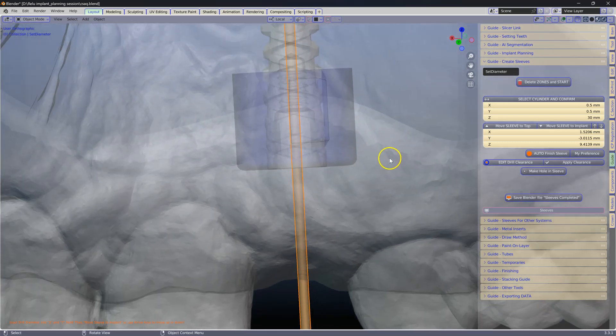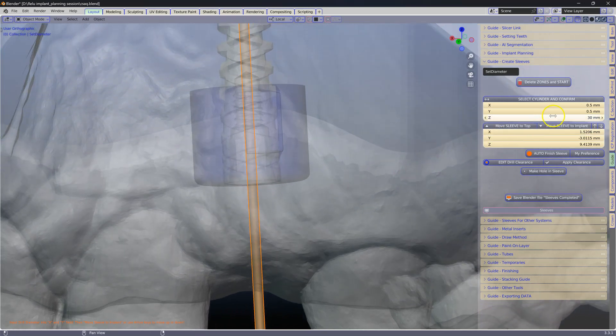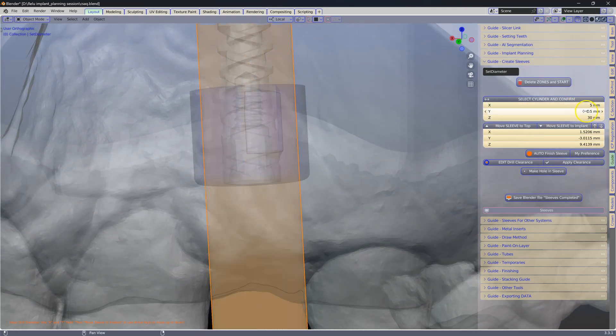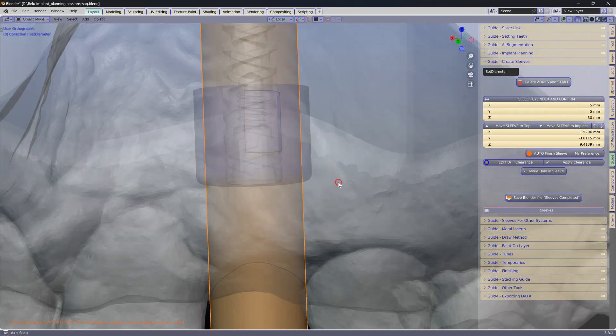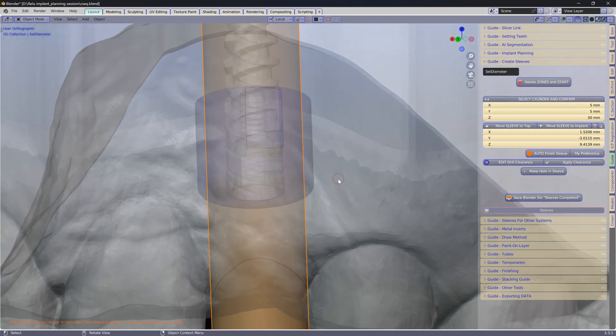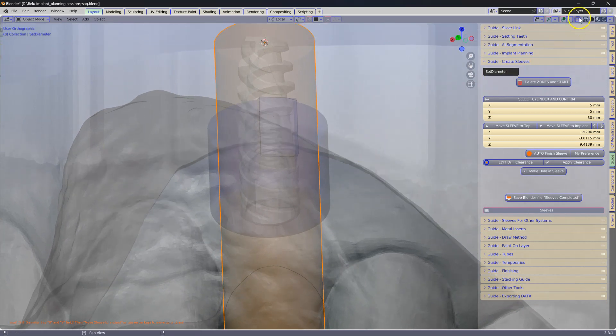We are going to now key in the diameter of our hole. Five by five. This may vary depending on your diameter of the hole.